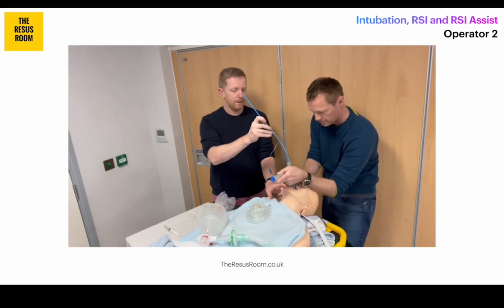So this is a really critical moment. There's been some very clear communication between the two of us that I have now got hold of the ET tube and Simon is holding the bougie. And so Simon holds the bougie still while I slide the tube down over it.